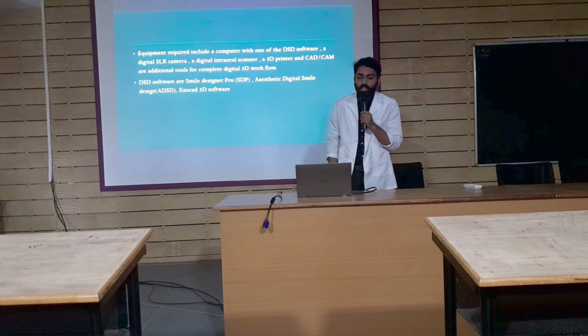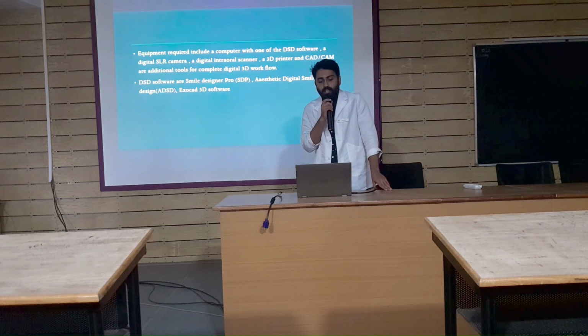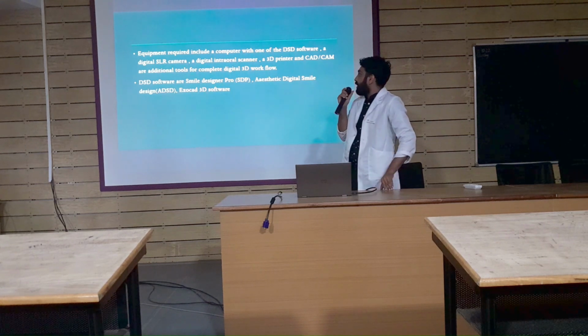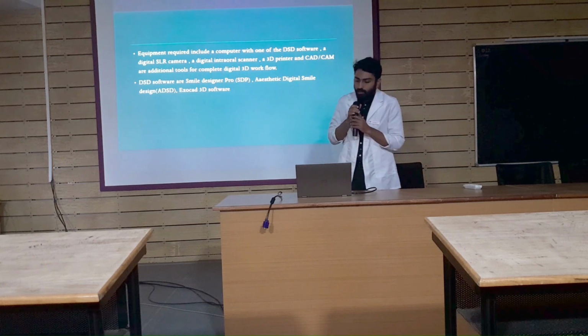So the equipment includes a computer with one of the DSD software, a digital SLR camera, a digital intraoral scanner, a 3D printer, and CAD/CAM as additional tools for a complete digital 3D workflow. The softwares that are available are Smile Designer Pro, Aesthetic Digital Smile Design and ExoCAD 3D software.